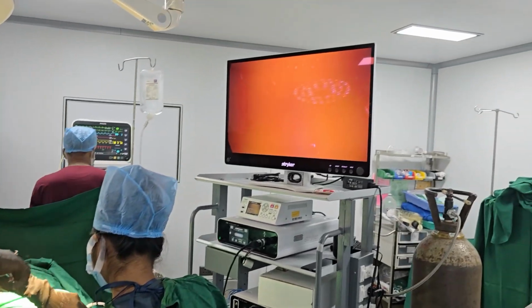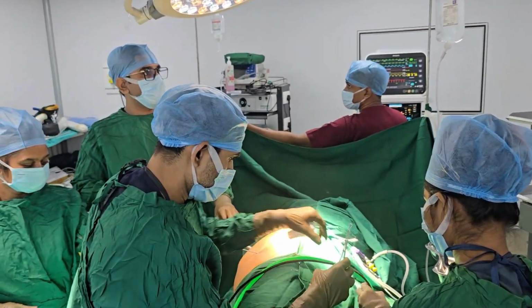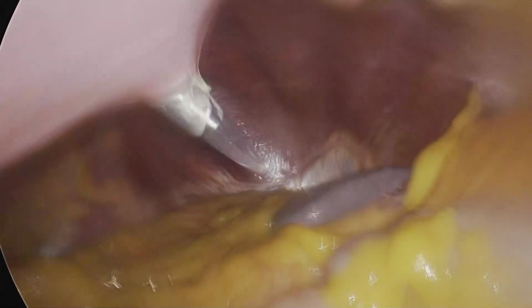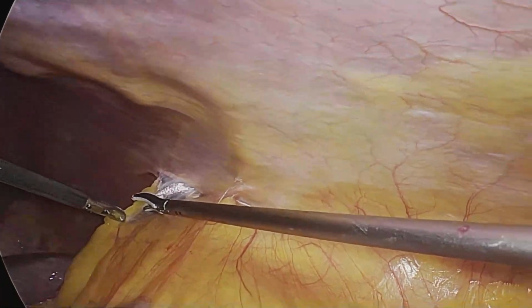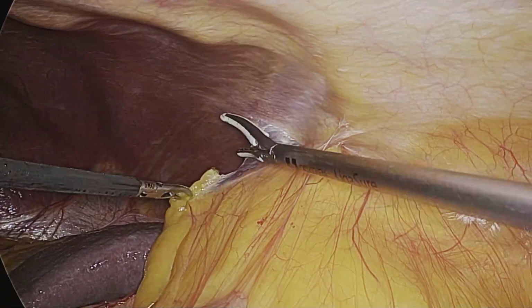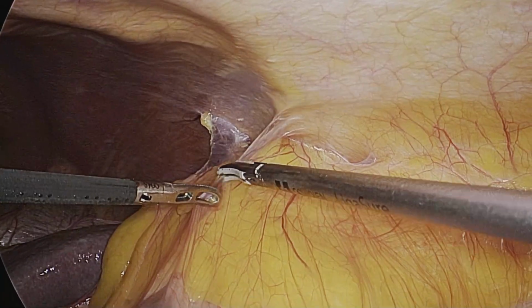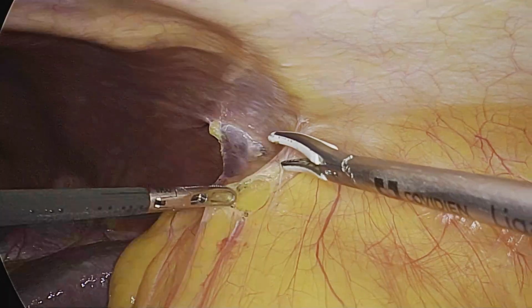Standard ports are being placed, and the pneumoperitoneum was created by Veress needle, and the dissection will proceed as in any standard radical nephrectomy. The initial steps are the same. The dissection proceeds with an incision just medial to the line of Toldt, and a plane is developed between the mesocolic fat and the Gerota's fascia.